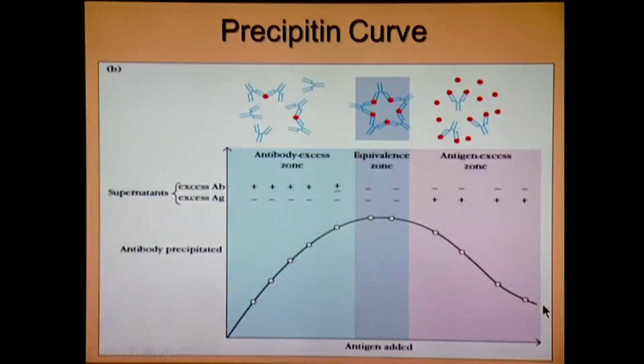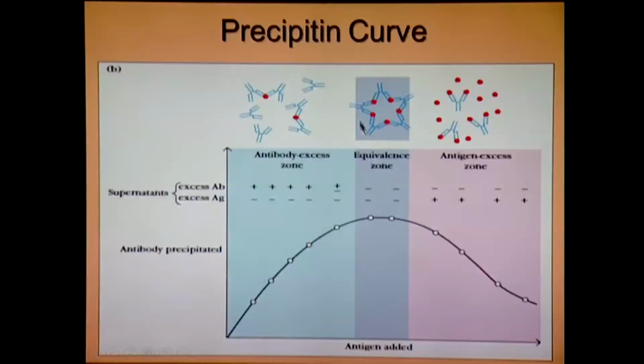Again, when antigen is in excess compared to the antibody, each antibody molecule will bind to the antigen separately. Again, they will not form any lattice. But when antigen and antibody are present at equivalent concentration, then they have to share epitopes present on an antigen. So they will compete for the epitopes and form a lattice. When the lattice becomes large, it becomes insoluble and is precipitated out.